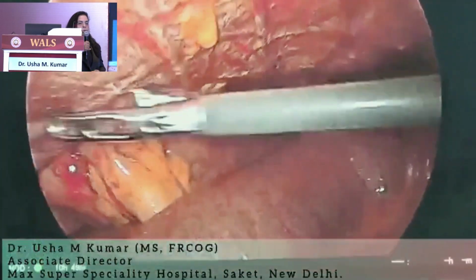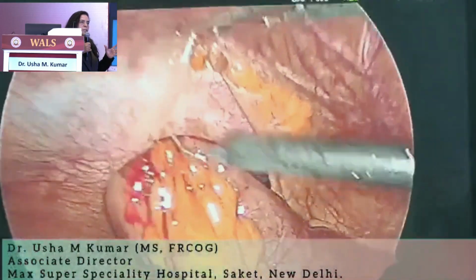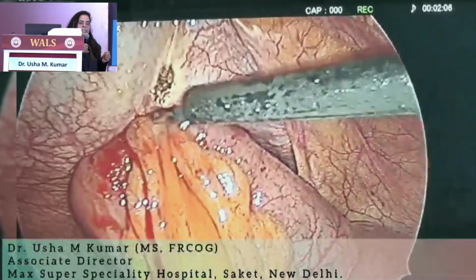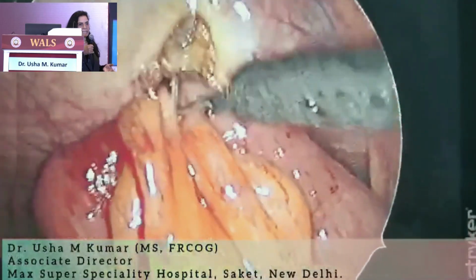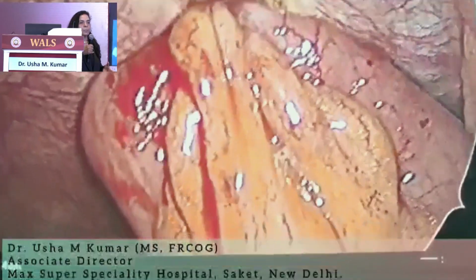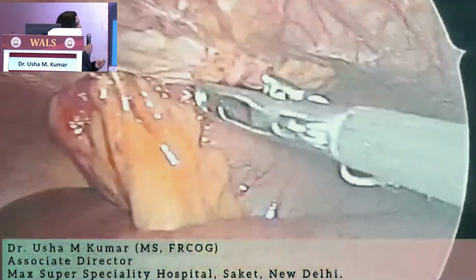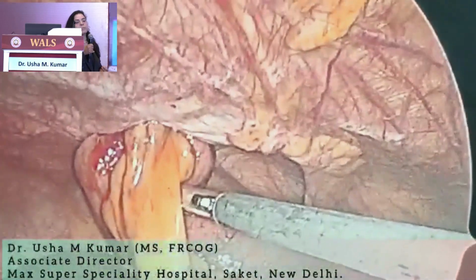This is a very interesting video. I just wanted to show all of you, because when we do surgery, we are bothered to do port closure only for the ports which are more than 10 millimeter in size. But this patient who underwent surgery with me, I was 100% sure that I did the port closure very nicely, and on the 4th day of the surgery she started having nausea, vomiting, pain in abdomen and distension. So we were wondering what went wrong, and when we did a CT scan for this patient, this was the picture. To our surprise, the bowel got herniated through the 6 millimeter port.